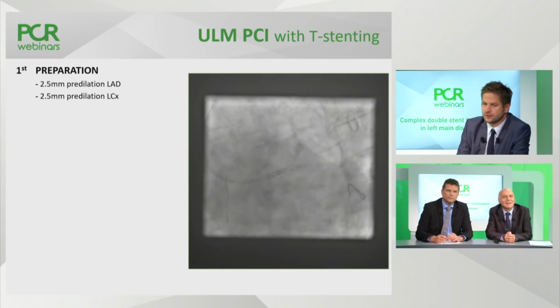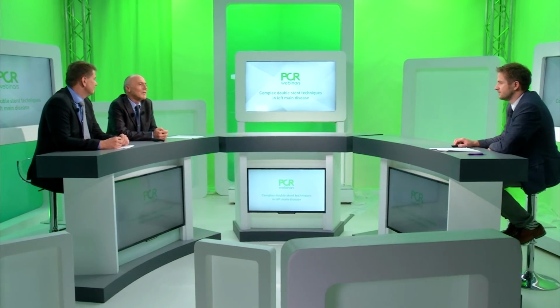Do you consider pre-dilation in case of left main as mandatory or optional? I think it's optional. It depends upon classification, upon the anatomy. You just have to tailor your strategy to what you see on the angiogram. What about you, Christoph? In left main, I rather tend to pre-dilate because I really want what you said. I want to get a feel for the lesion. I want to have an understanding of how the balloon behaves. So for me, it's mandatory, but I cannot speak for others.